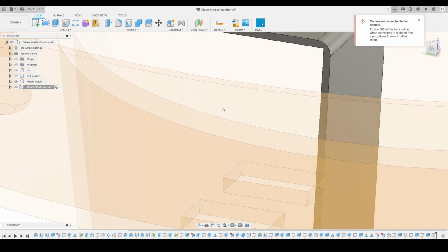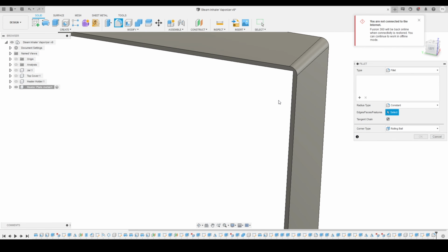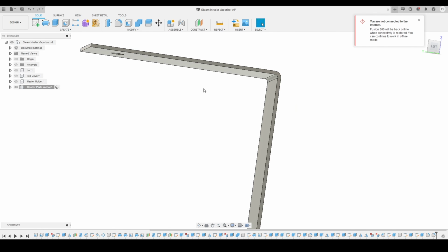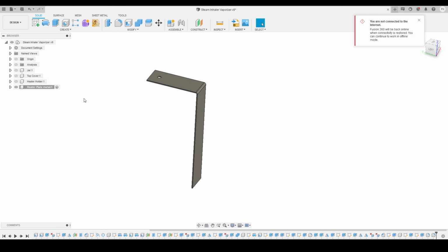So I will apply a fillet of 1 millimeter on the outer side, whereas on the inner side, before that I will just turn off the heater holder and then I will apply a fillet on the inner side, maybe 1 millimeter will work, or maybe 1.5 will work. I just have to check, maybe 0.5, I think 0.5 will work, so I will press OK. Here you can see. Now again I will turn off my heater holder, and here you can see.